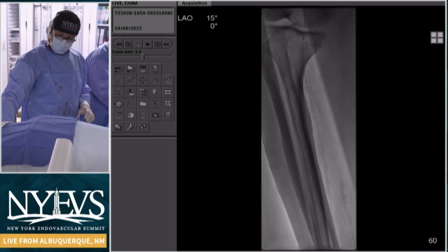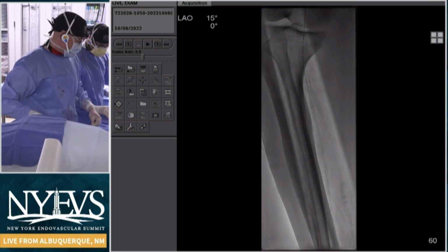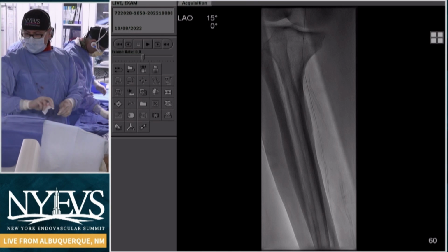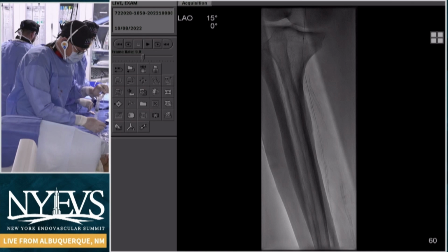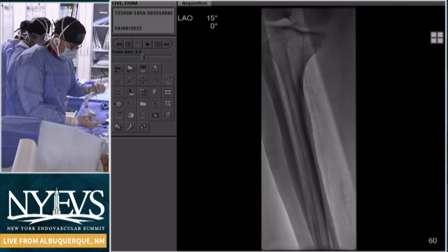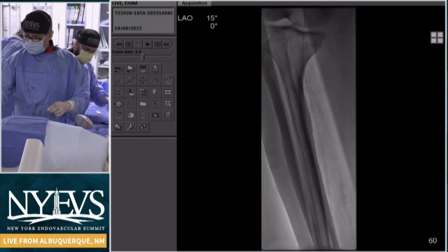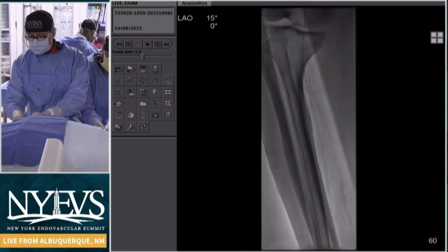Yeah, I think so. Especially with the shortage we faced back in the spring, right? Yep. Absolutely. So Steve, do you have any tricks for people? I mean, my experience has been that CO2 is great for big vessels. Once we get down in the tibials, unless you have a catheter down, it's hard to get really good pictures. So you want to share some of your tips and tricks for those tibial images with CO2?